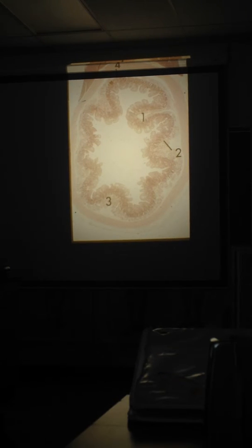And then the last concern for small intestine is to see the hills in the wall of the small intestine. And then to see the size difference between the hills and the trees on the hills. So here are the trees. You know them as villi, the fingers.